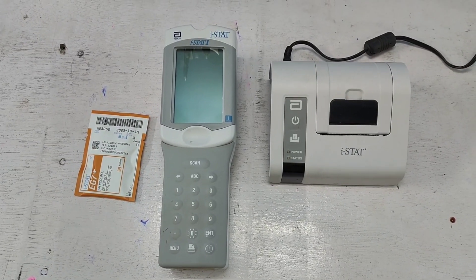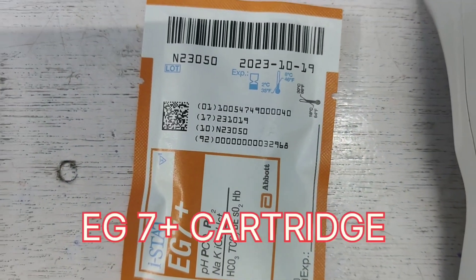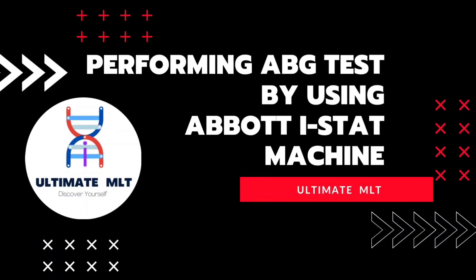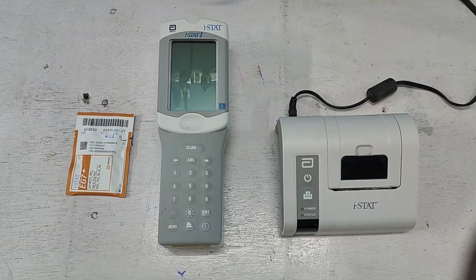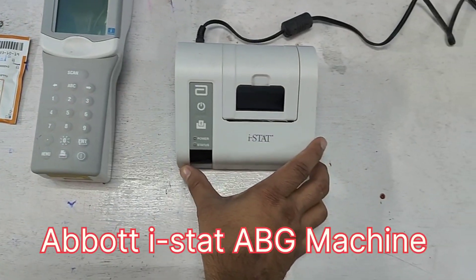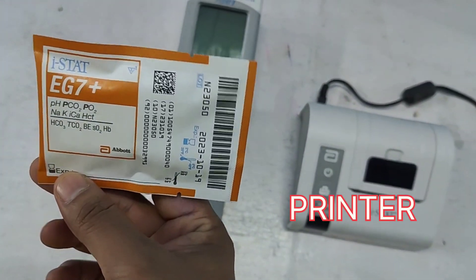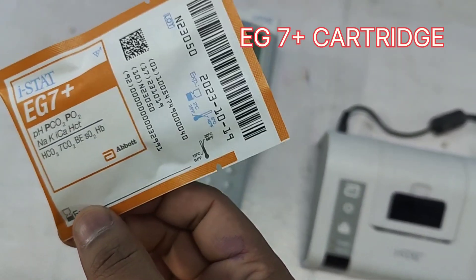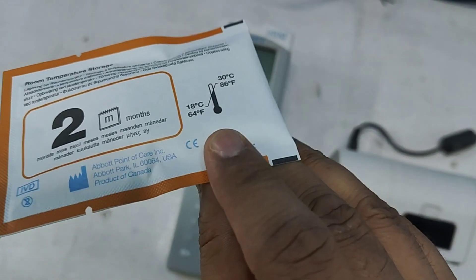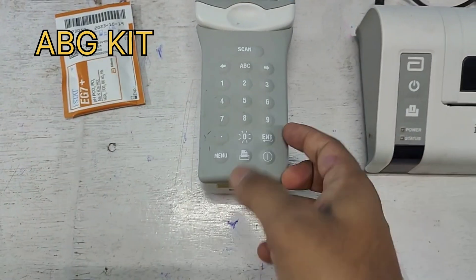Hello friends, in this video I am going to show you an ABG test using the iStat machine and the EG7 Plus cartridge. This is the iStat ABG machine, and this is the iStat printer for the ABG machine. This is the EG7 Plus cartridge kit. The barcode has an expiry date and lot number. Let's have a close look.